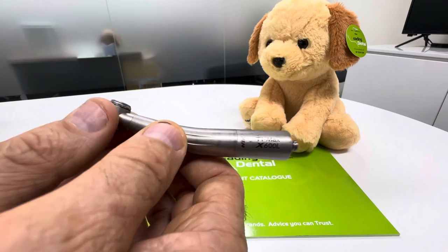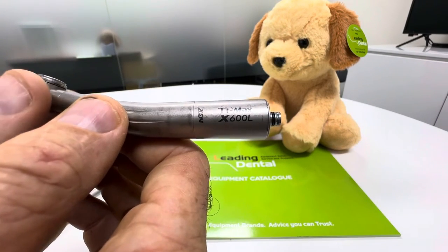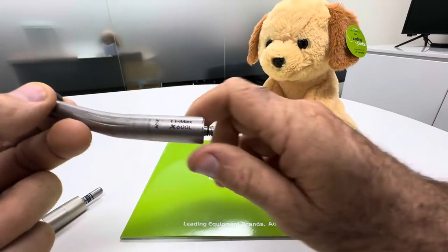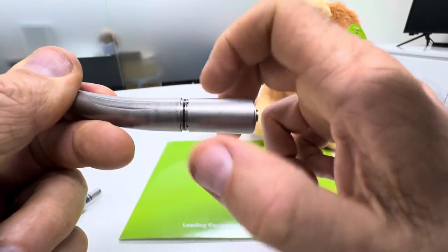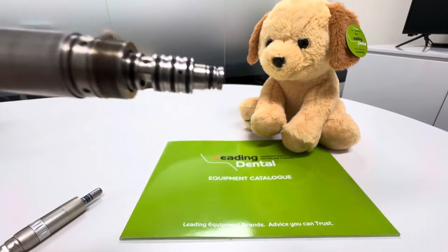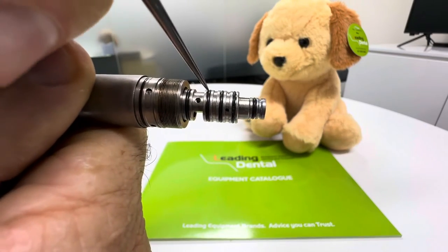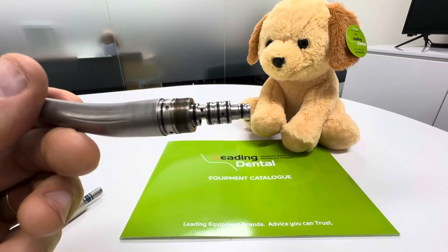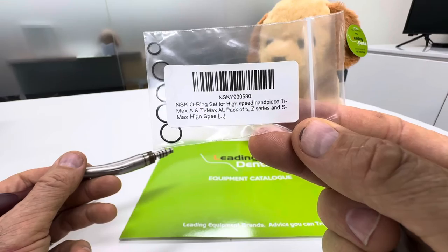High-speed handpiece — again we've got one of the older style X series, the X600L titanium here. Now all the o-rings on the NSK are hidden up under a little shroud, so what we do is just grab the end and unscrew that. That exposes all these o-rings in here. In this case we've got one, two, three, four, five o-rings — and if you buy a replacement pack of PTL o-rings, surprisingly enough you get five o-rings in that little packet.